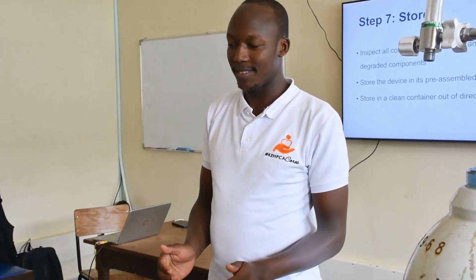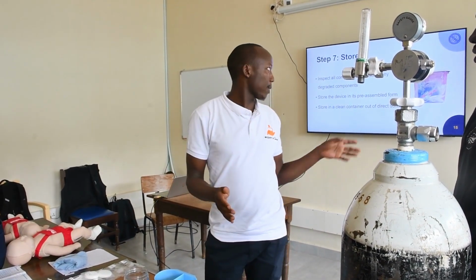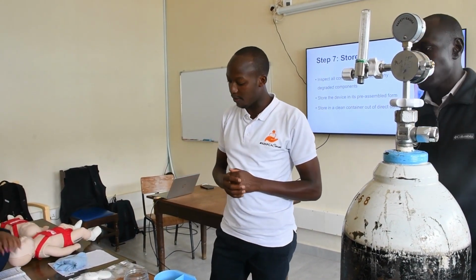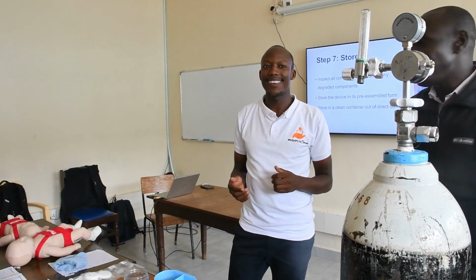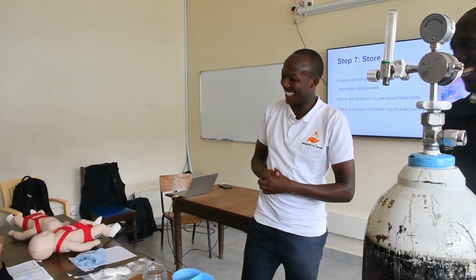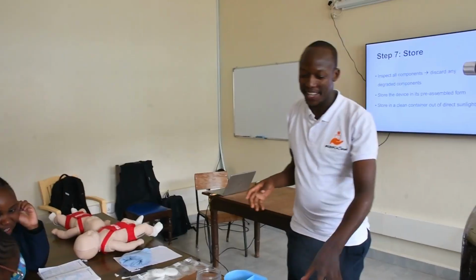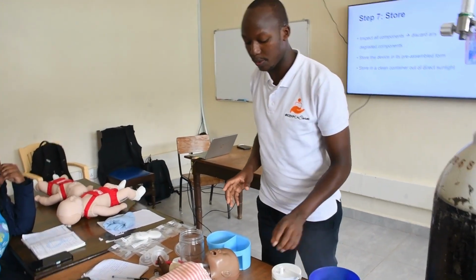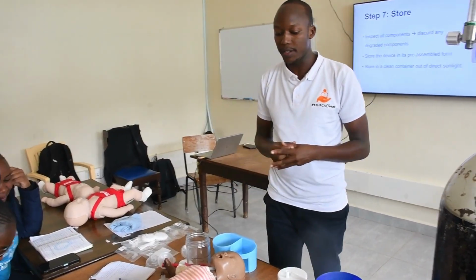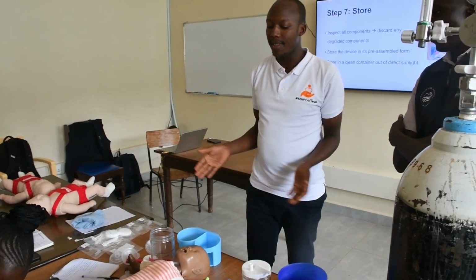You will see the system now. So when we initiate, first of all, we start with when to connect this system, maybe to our patient. So first of all, we make sure that we have all the requirements.